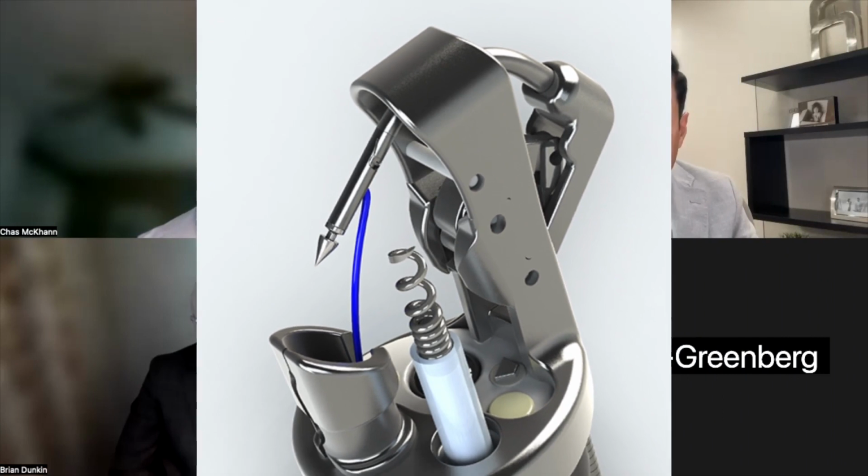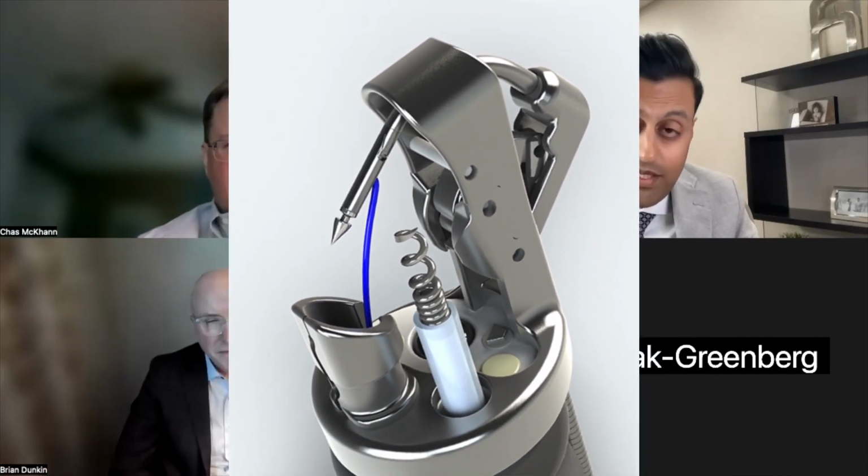I know that in our interventional practice, we utilize it on a regular basis. Honestly, there are very few days that we're not doing some form of suturing, whether it's suturing stents, suturing perforations, or cerclaging down openings for gastric outlet reduction. There's a myriad of applications, and I think we're stumbling upon even more and more. But how do you get through that engineering roadblock?